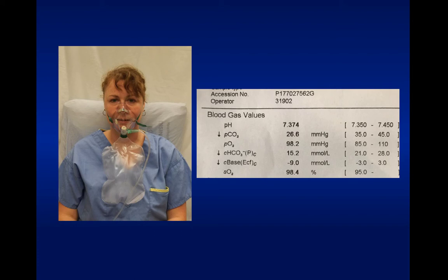This woman here, a PO2 of 98 when you're breathing 60 to 90% oxygen, she must have something really serious going on. She's either got significant respiratory disease, or significant heart disease with a shunt. That's right. So she's got something causing a blockage of gas exchange, so the oxygen is not getting from her respiratory tract into her bloodstream. That's a really bad sign. So the point I'm making is that you need to involve the patient and the clinical history.